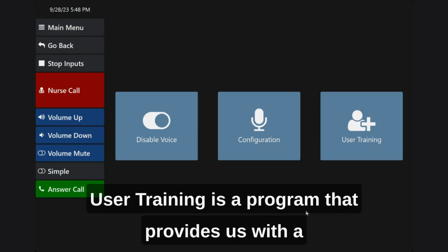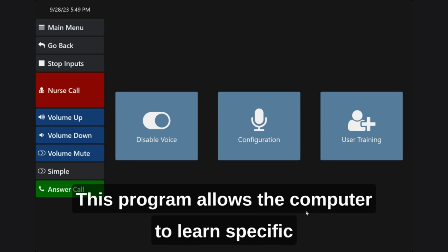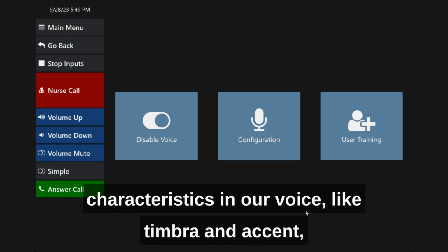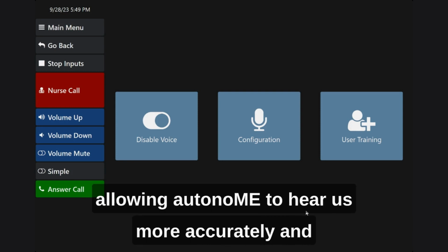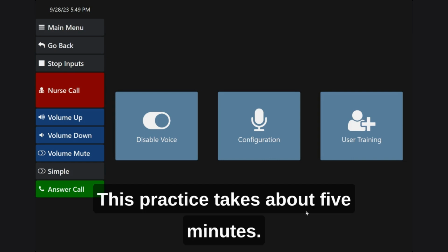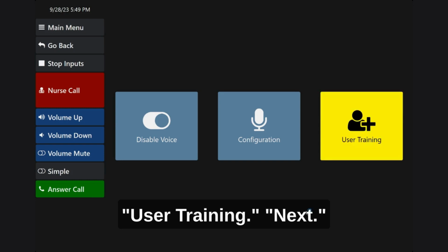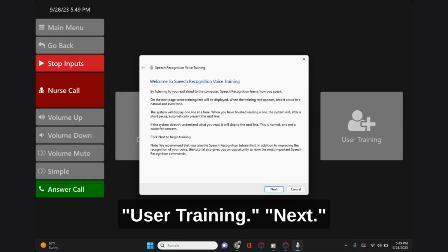User training is a program that provides us with a series of phrases to read back to the computer. This program allows the computer to learn specific characteristics in our voice like timbre and accent, allowing autonoME to hear us more accurately and ensuring a better overall experience. This practice takes about 5 minutes. Let's walk through it together. User training. Next.